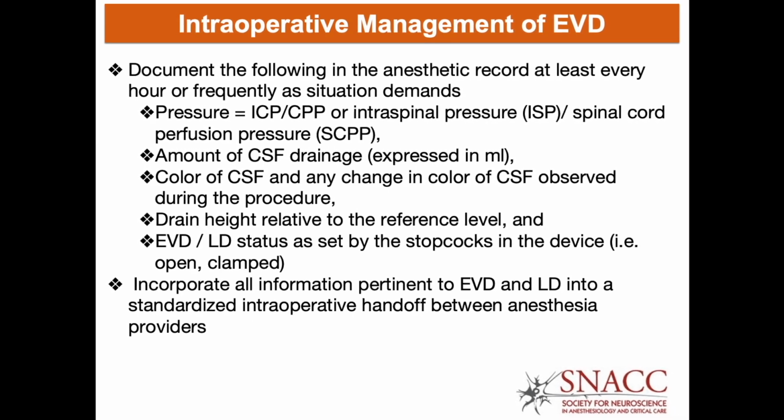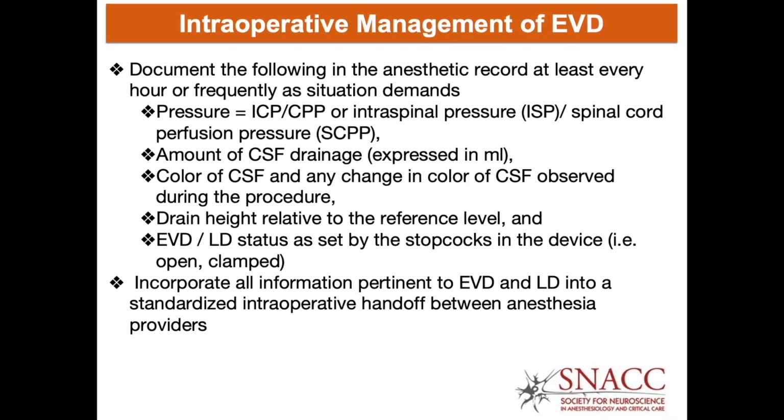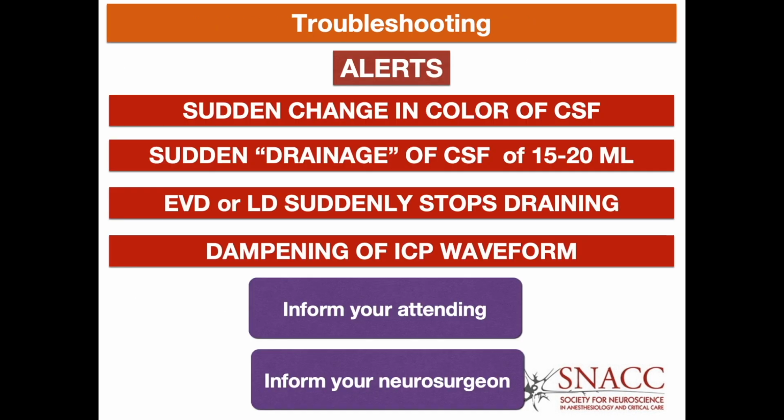Xanthochromic or clear drainage that turns into hemorrhagic drainage may be indicative of an intraoperative rupture of an aneurysm. You should also note the drain height relative to the reference level, and note all positions of the stopcock, whether they be open or closed to the patient.